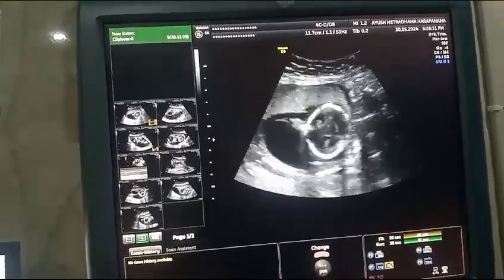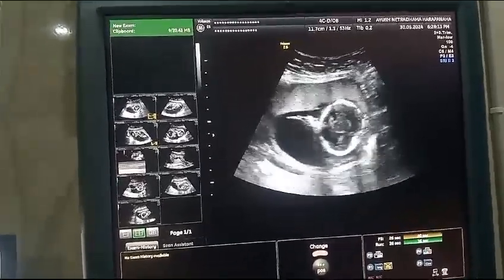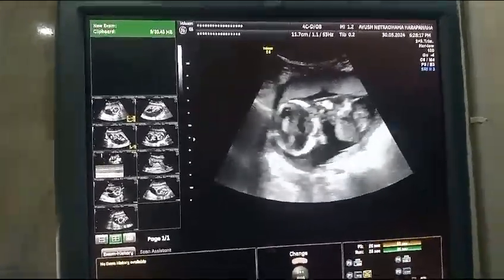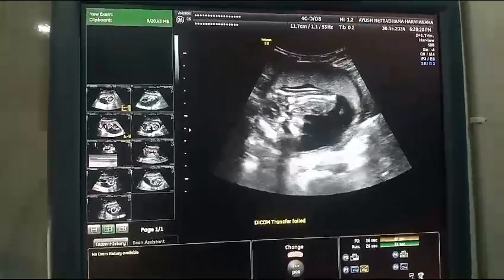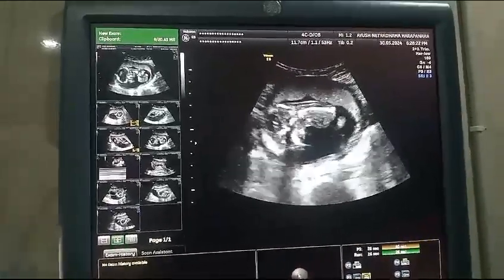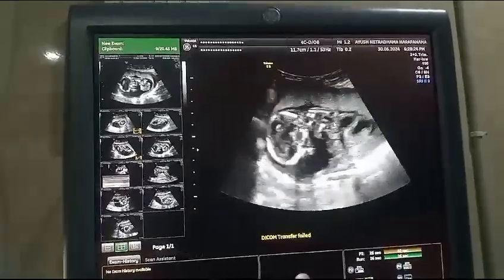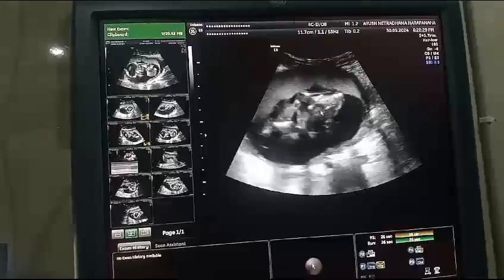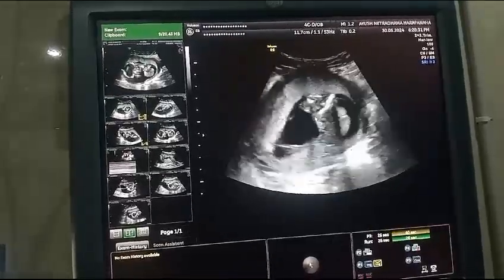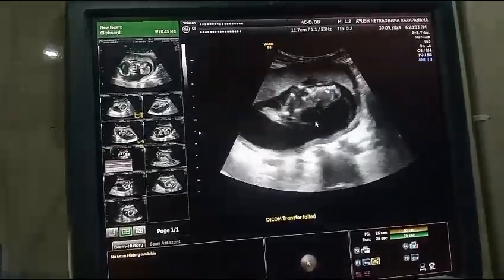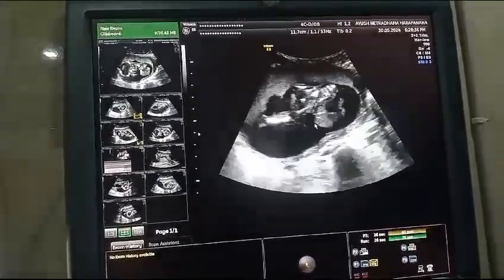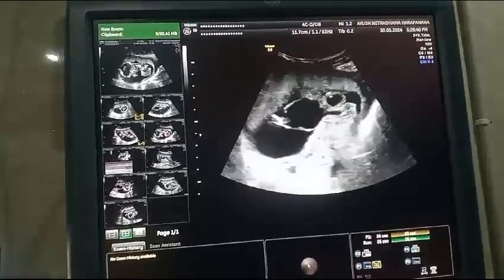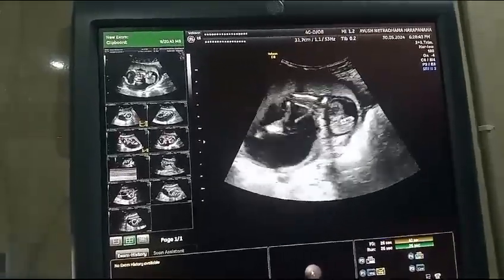Good evening, this is Dr. Kishan and this is a 16-week gestation. We can see the cranium here and as we try to see the whole of the fetus, we see that the spine appears to be deformed and the thoraco-abdominal region is not well formed. All the thoraco-abdominal viscera are outside the fetal thoraco-abdominal cavity and are covered by a thin membrane.